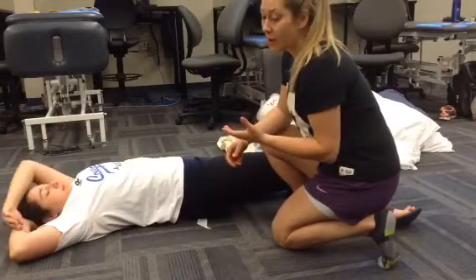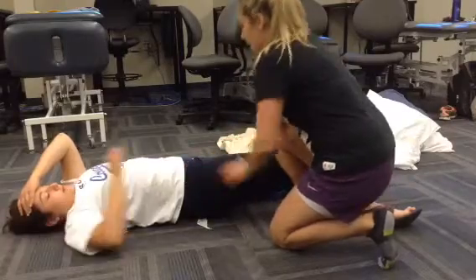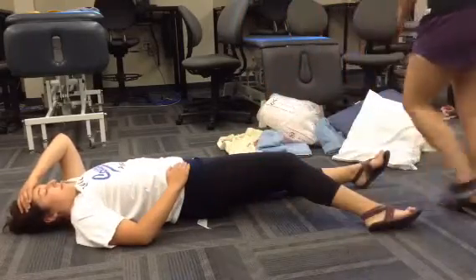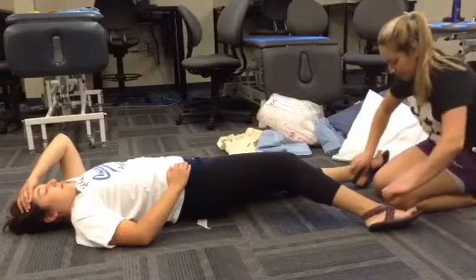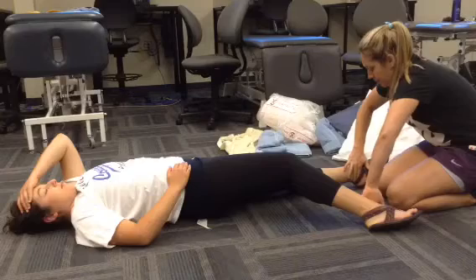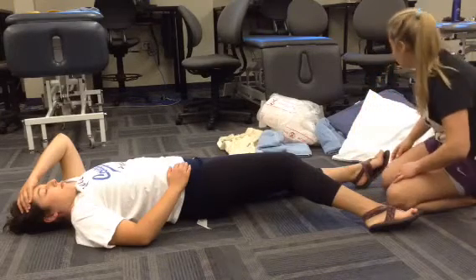I don't have an extra helper today, so I'm just going to have the patient manually stabilize themselves. Next, I would check PMS. Can you feel me touching you? Can you wiggle your toes for me? Pedal pulses are present.